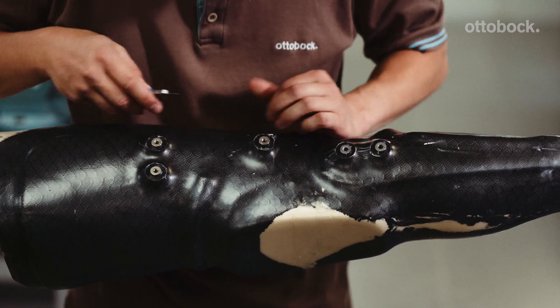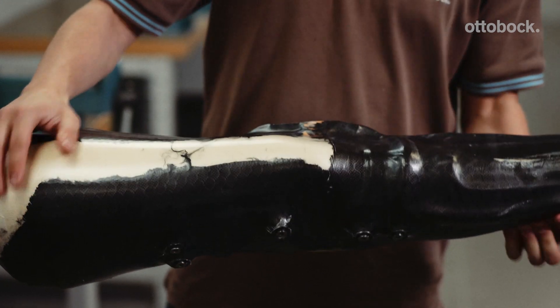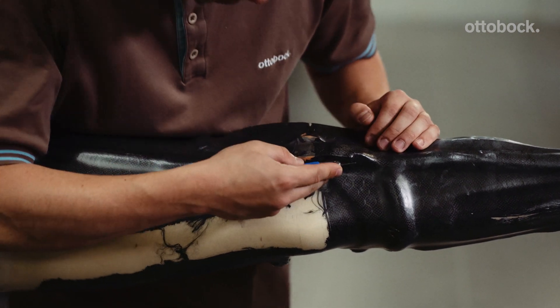Expose and remove the dummy anchor nuts. Make sure that the upper section of the anchor nuts, where the joint unit is later applied, is clean. Remove any resin residues.